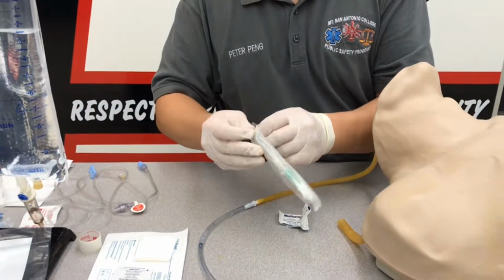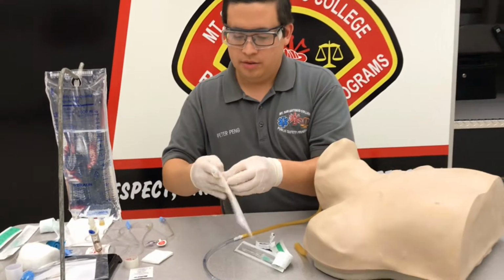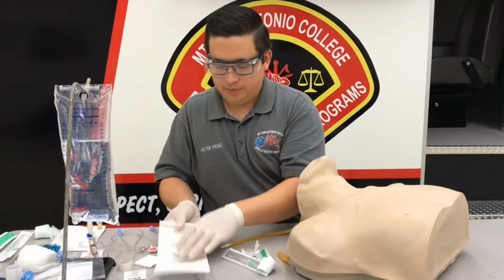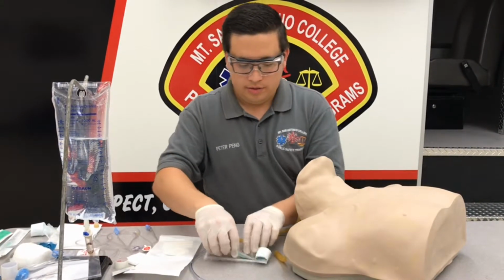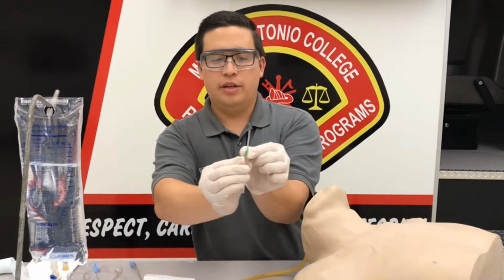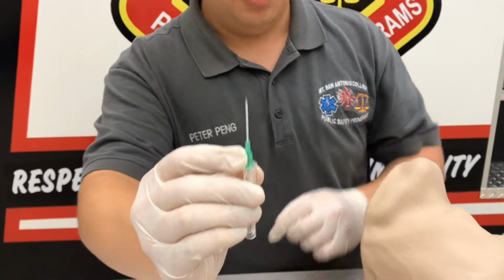So open up your IV catheter and open up your Venous guard. All right, so we're gonna take off the cap and make sure that you twist the catheter here to loosen it up and maintain control of that catheter so it doesn't move.